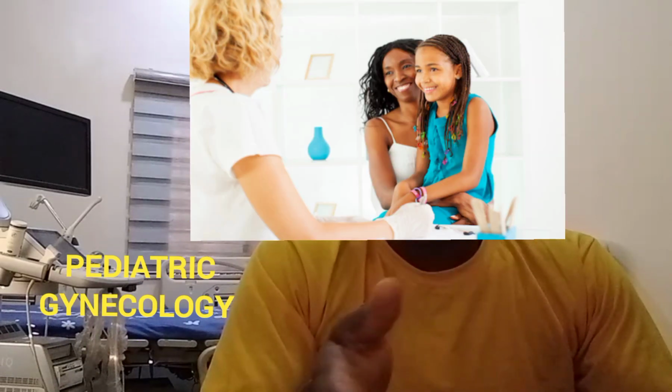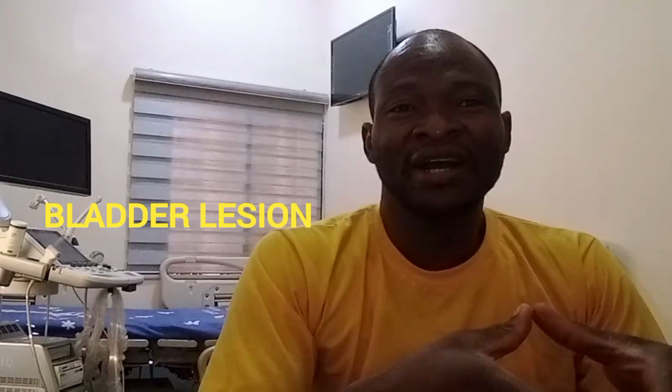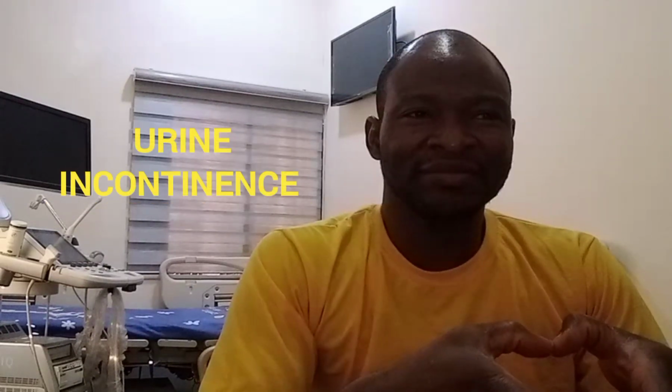We also would do pelvic ultrasound in pediatric gynecology. That's evaluation of pelvic mass or any ambiguous genitalia, precocious puberty, and primary amenorrhea. Other indications will include bladder lesion and urinary stress incontinence.